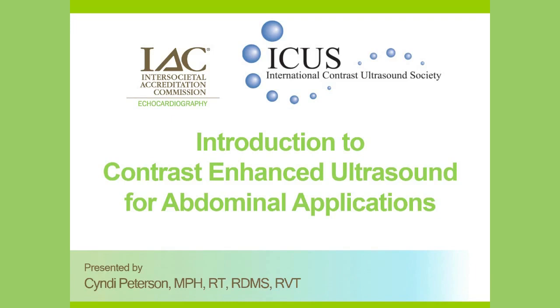The objectives for this presentation are that the attendees understand what ultrasound contrast agents are, how they work, why we use them in non-cardiac applications, and how we can use them to better image patients, especially in the abdomen.